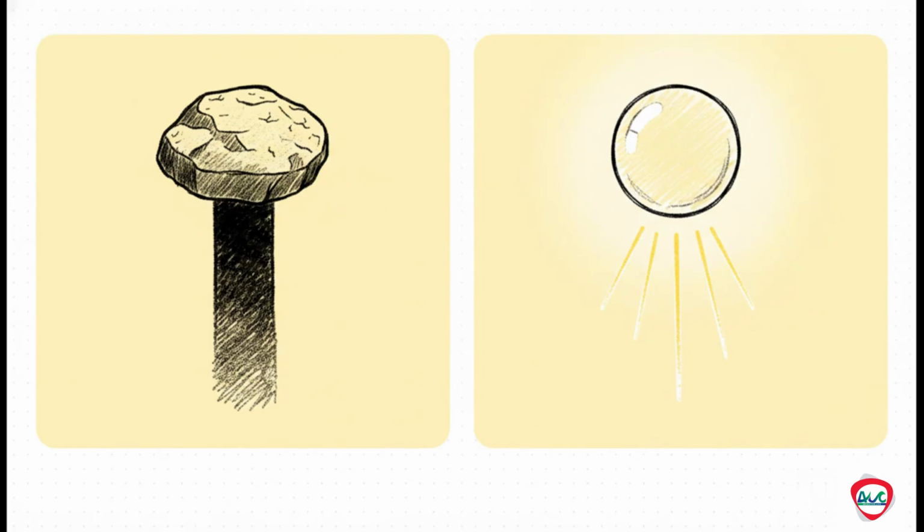Acoustic shadowing drops a huge dark void behind a structure. That's not an error, it's a massive diagnostic clue proving the structure is highly dense or calcified, like a gallstone. On the flip side, posterior enhancement throws a bright white spotlight behind a structure. That proves the sound traveled through that area with zero resistance, essentially confirming you're looking at a fluid-filled cyst.